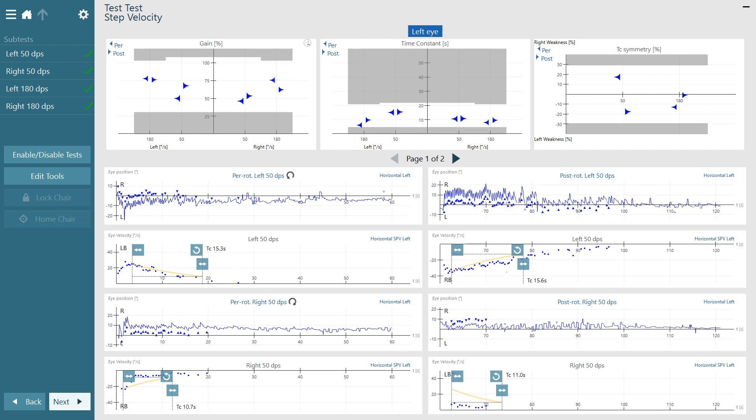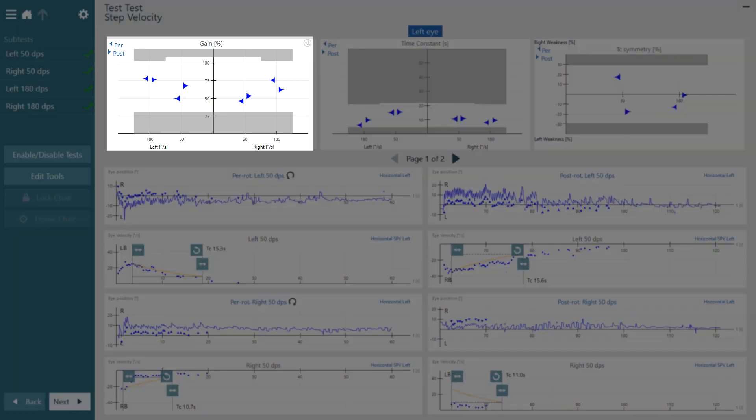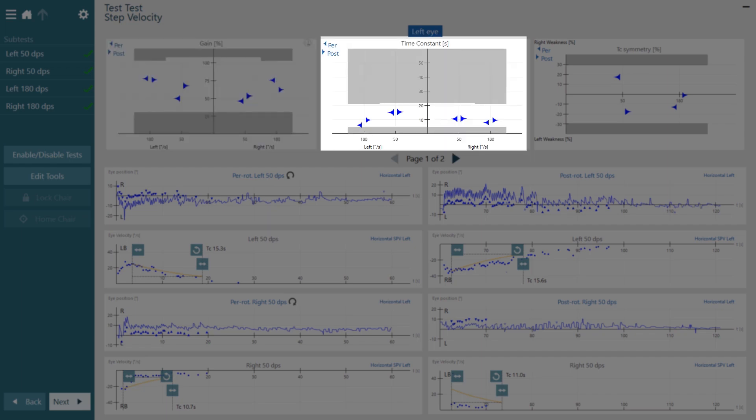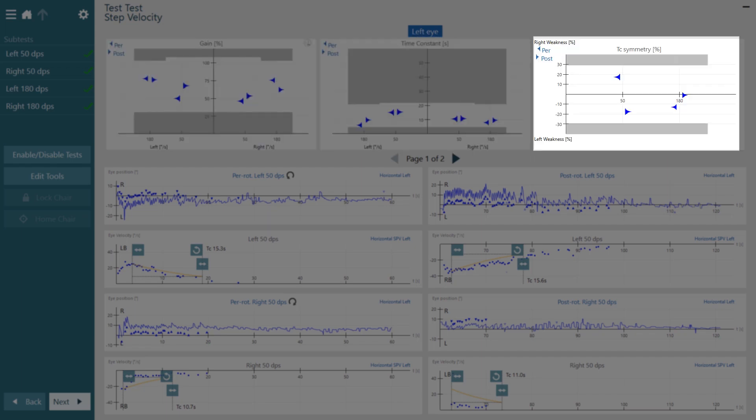Although step velocity test is the oldest rotary chair test, it is worth noting that ordinarily it is only measured if indicated by the sinusoidal harmonic acceleration test. When reviewing the results, we have three main parameters: the gain as a percentage, the time constant, and the time constant symmetry.